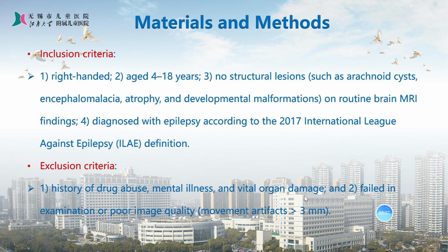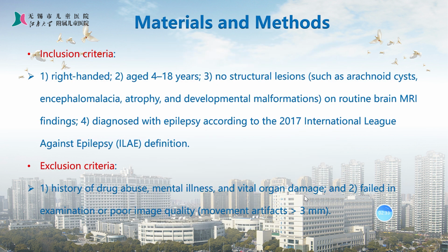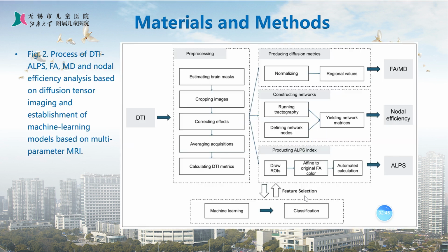We retrospectively included pediatric patients with epilepsy. The inclusion criteria and exclusion criteria were as follows. Finally, 26 RE and 70 DSE children were included in this study.